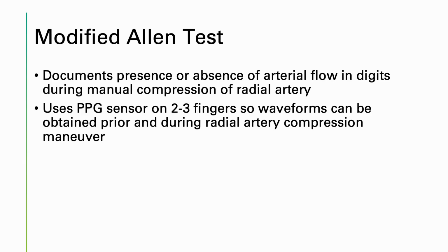If I gave you a picture of that, could you identify? You would know because I'm going to show an artery in the upper arm brachial to the cephalic vein, a connection, or lower arm radial to cephalic. Those will be the two main types. When we look as sonographers, when we do an ultrasound on a dialysis fistula, what are we looking for? We're looking for patency. Is it patent? Is it open? Is there blood flowing through it normally? Is there stenosis, which is a blockage, would give us a very high velocity? Is it occluded, which means clotted off, no blood's moving through?